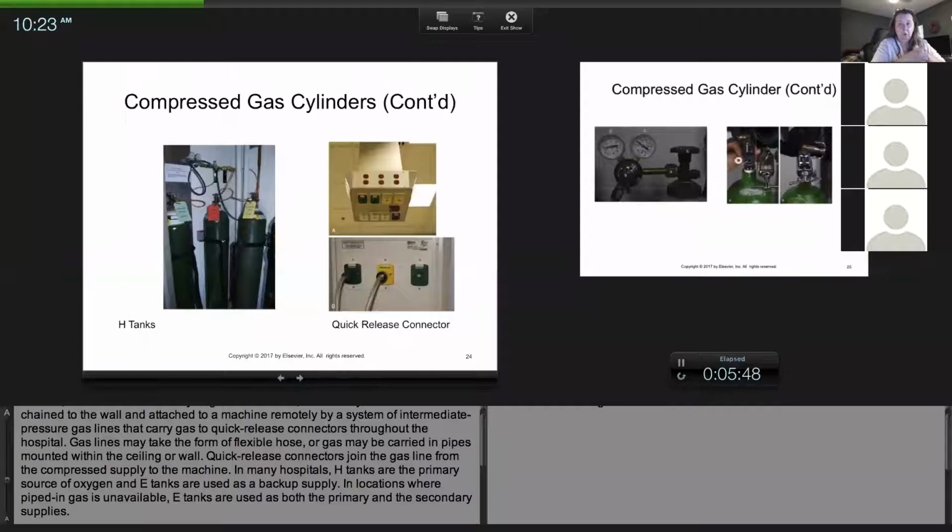But I've had people empty a tank and not change the tag. One tank ran out and I went to turn on the other tank and it was empty, and they never changed the full sign. This was when I was at Purdue. So that's why it's essential. Yeah, I had to go running for another tank. We had to disconnect the animal, use an ambu bag to bag them, and I had to run for another tank. And I was taking over a procedure for someone else.